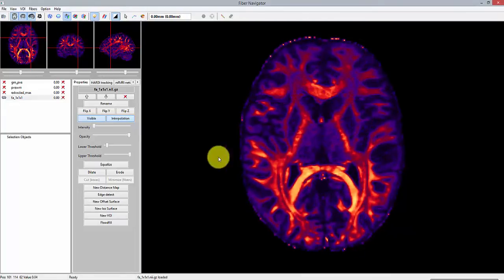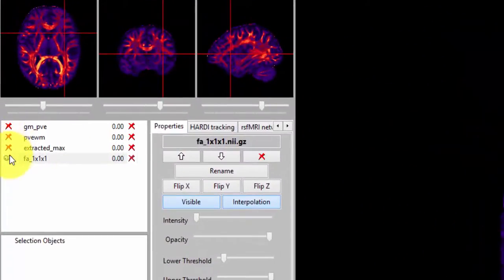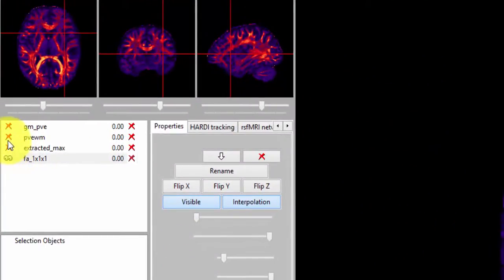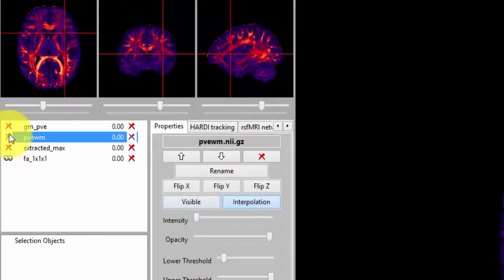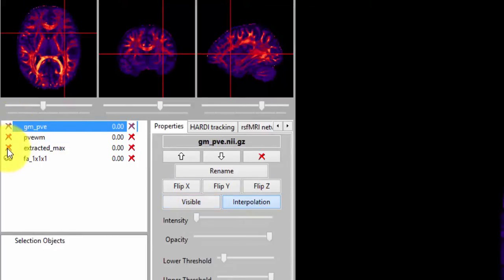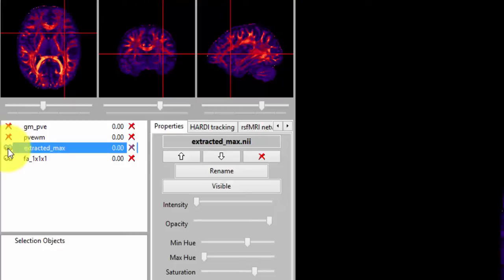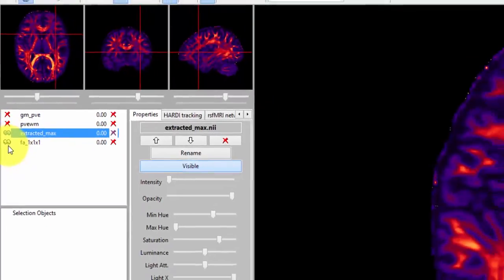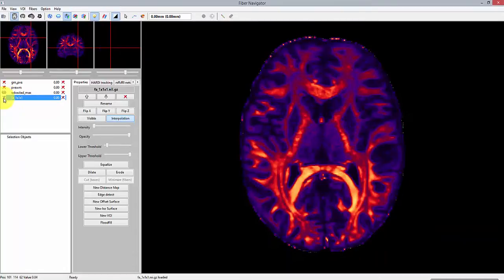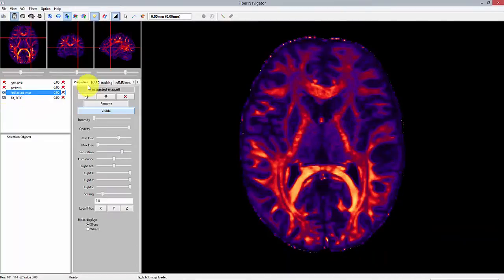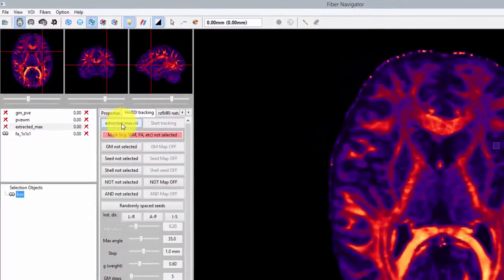So here, as you can see, I have an FA map which will serve only for visualization purposes. We are in fact going to be using the white matter and gray matter mask to perform tractography. We also need a set of pre-computed peaks. In this case, they were extracted from fiber ODFs, but feel free to use any set of main directions issued from your favorite reconstruction method.